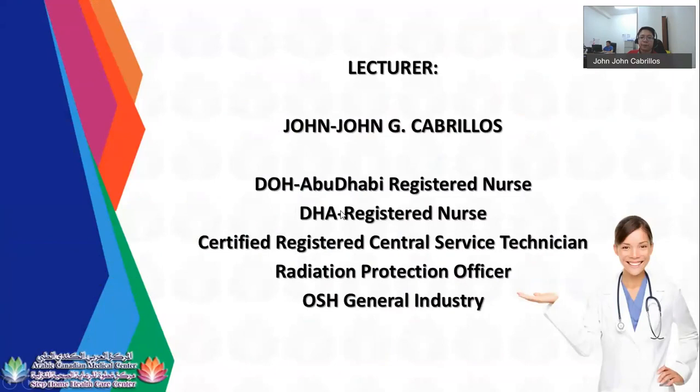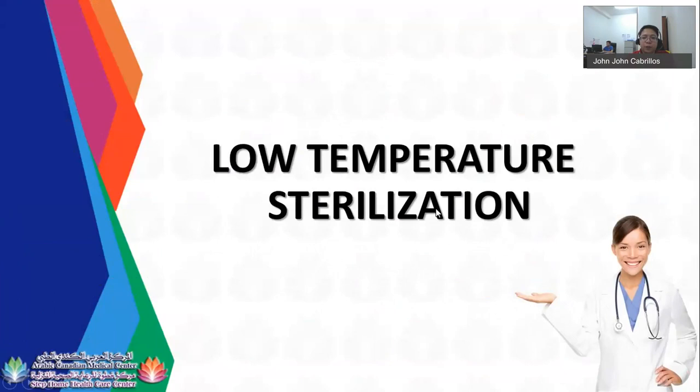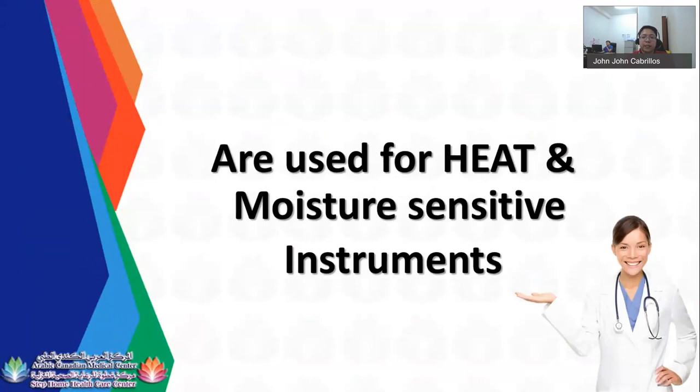So we will start to talk about low temperature sterilization. Low temperature sterilization is available for those instruments that are not capable of handling heat and too much steam. These are items that are heat and moisture sensitive instruments.